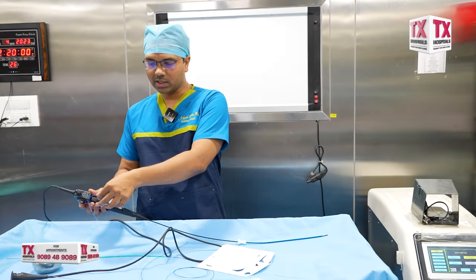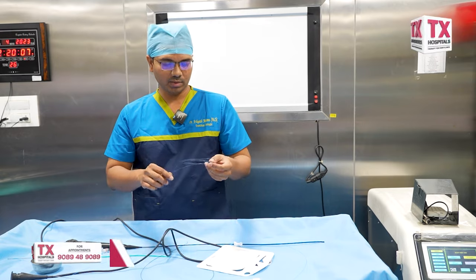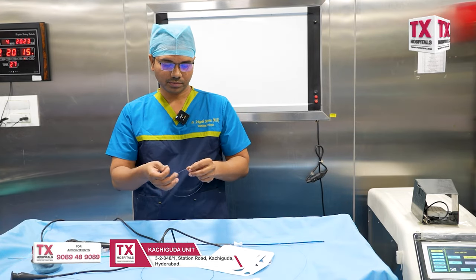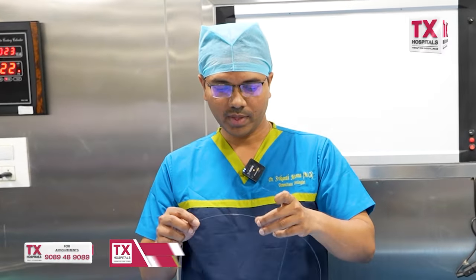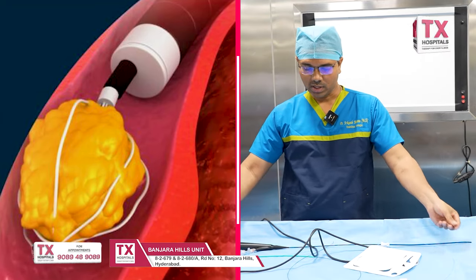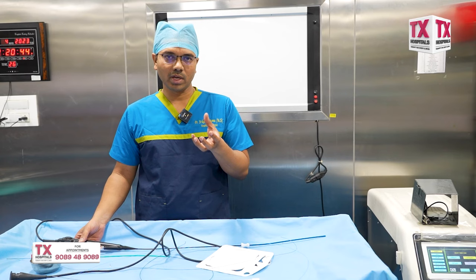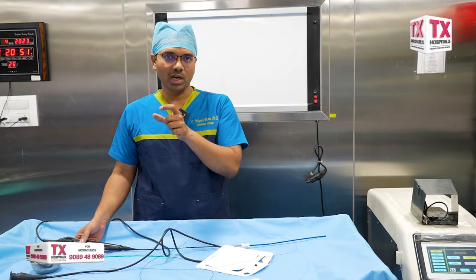We then use a basket — a flexible basket — passed through the other end of the scope to retrieve fragments. The mechanism of the basket is entirely different from the laser. You can observe the tip of the basket if you zoom in. After doing the RIRS, we use the basket to retrieve stone fragments — first we break the stone into fragments, then finally there is ultimate dust, the golden dust.